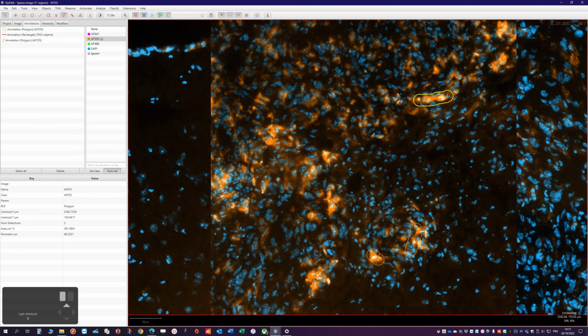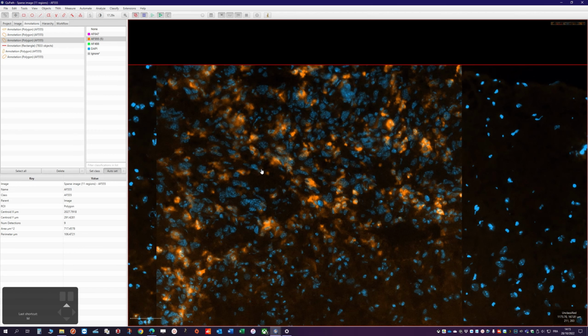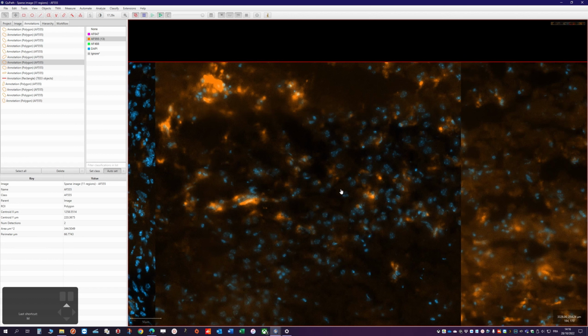Create quickly some positive regions there. Here also, like that. Okay. I won't be that precise in this case.